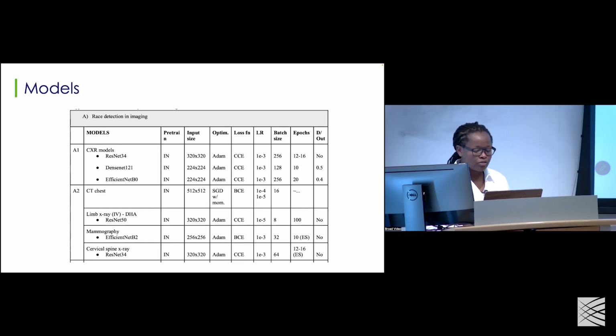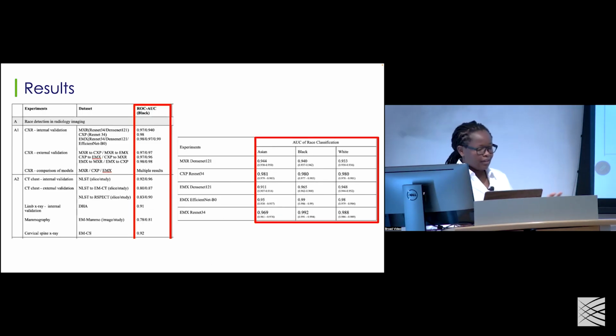And another concept is we've shared this model a lot, and people usually are able to replicate the results without having to fine tune, which is your dream when you start to think about deploying AI models in new settings, because we know that it's very difficult to have even similar performance to what you had without fine tuning on some subset of the data in your target population. And so we found that the AUC to identify Black patients for chest X-rays, with no retraining on a chest X-ray data set and then fine-tuning, just using ImageNet weights as the initial point, was 0.96.